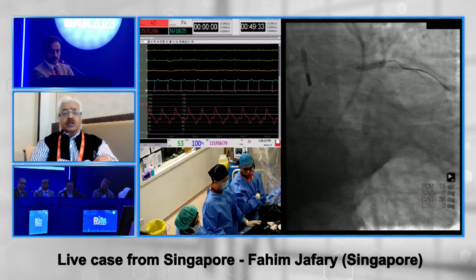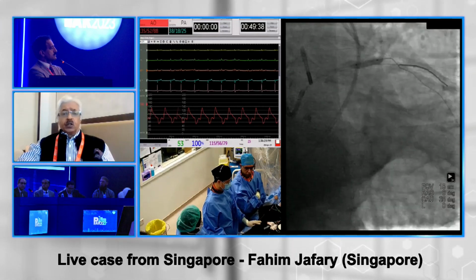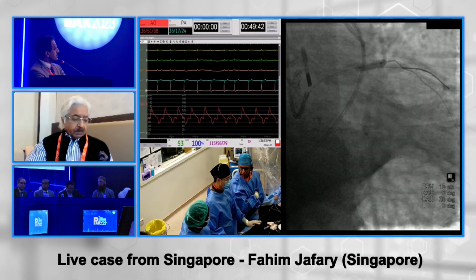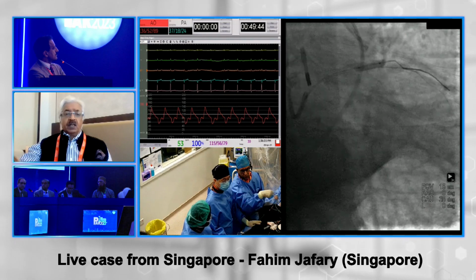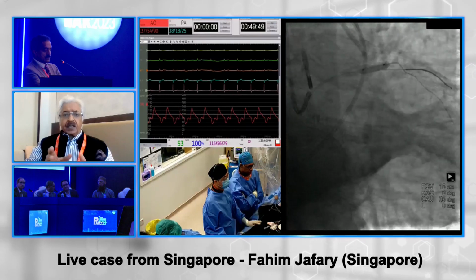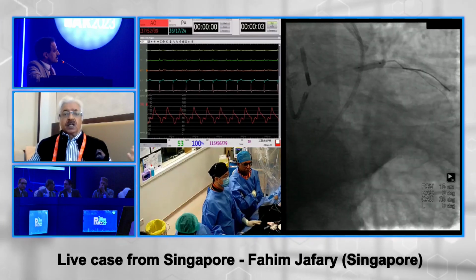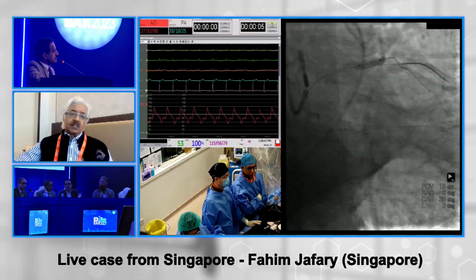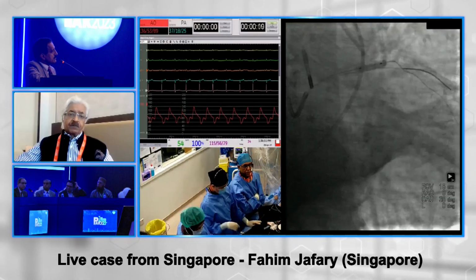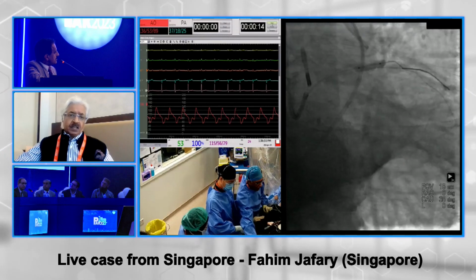You don't necessarily need to get rid of the eccentric stenosis, because at the end of the day, you want large lumens, but you'll only get large MSAs if you really crack that deep calcium. I think you can go ahead with IVL, especially in your proximal segment, where rotational atherectomy does an inadequate job, primarily because there is a small burr in a very large vessel. And here is where you actually need your IVLs, more than in the smaller vessels of 3 millimeter size or less after rotational atherectomy. So even in rotational atherectomy, it does work well in smaller vessels than in larger vessels.